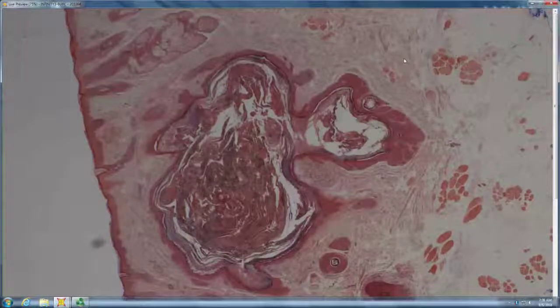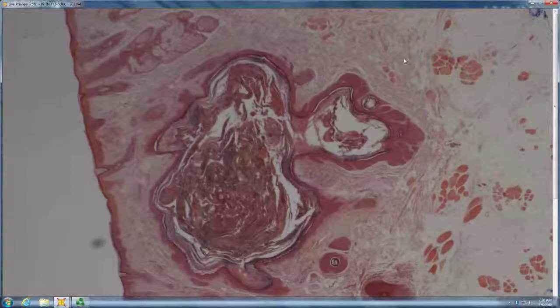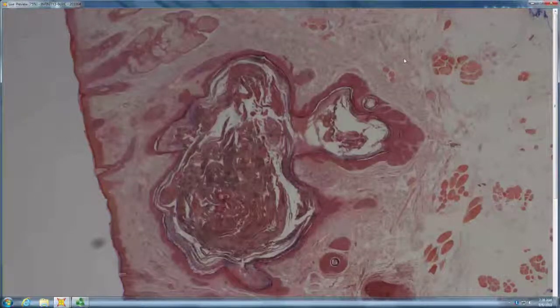In the case of pilar sheath acanthoma, there are fat squamous fingers. In a pore of Winer, they're skinny squamous fingers. And in a trichofolliculoma, they are fully developed follicles.